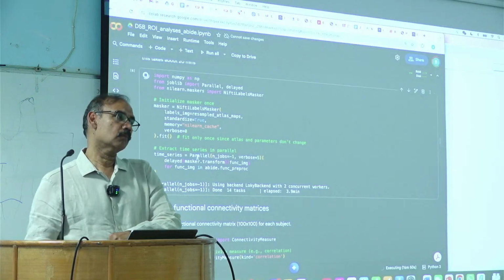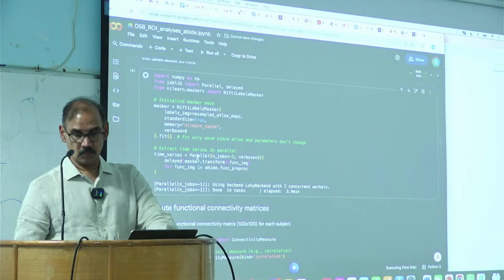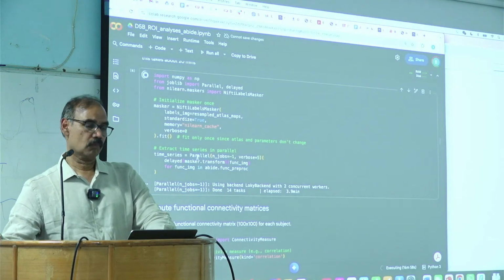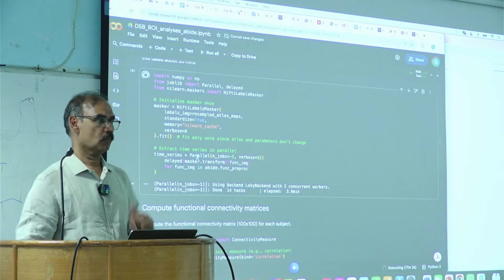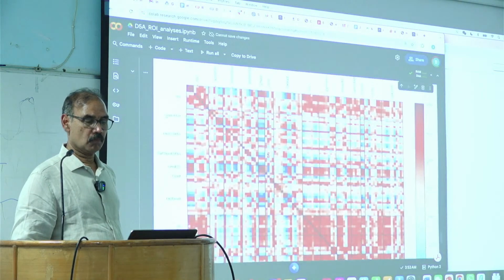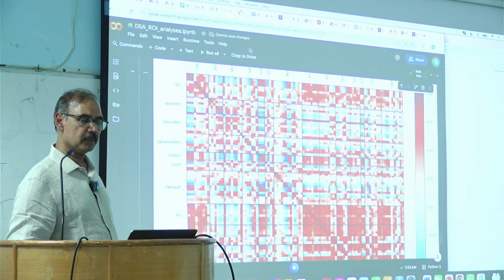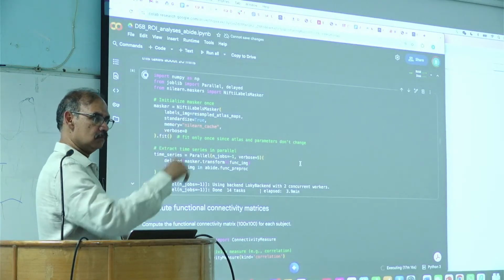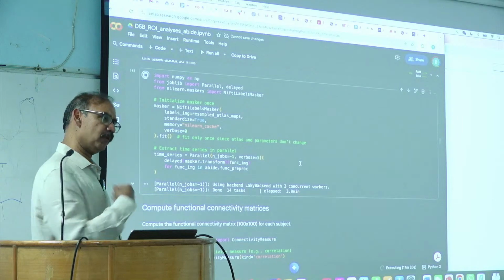That's the severity of the symptoms. Now, based on this stratification, we get three connectivity matrices from the severities and one from the healthy control, and then compare them using a t-test. When you say functional connectivity, you're not using ICA, you are using ROI pairwise correlation. Okay, and then what will you do?